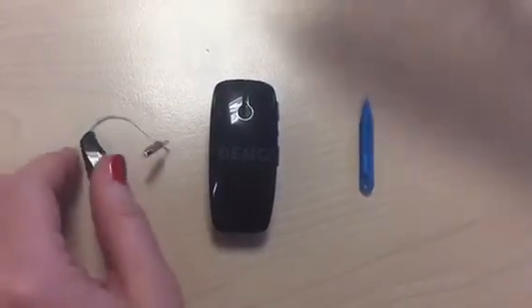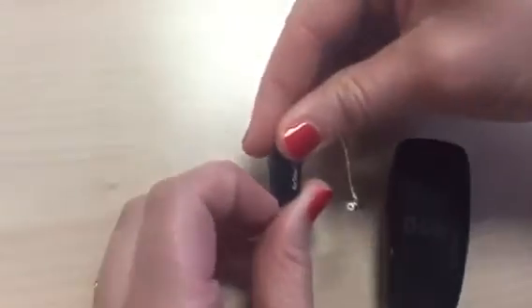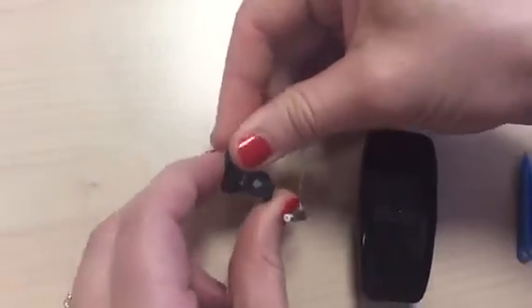To start with, take the hearing aid and open the battery door, turning it off.